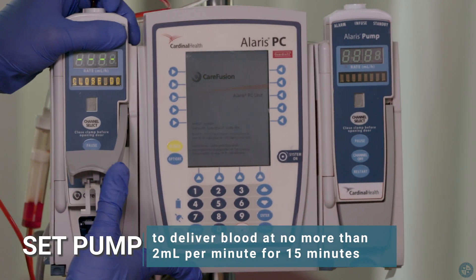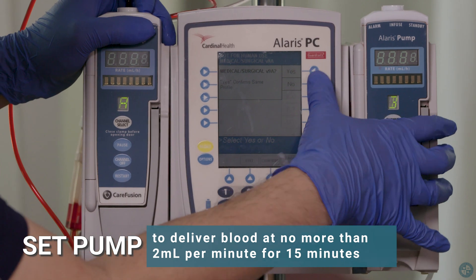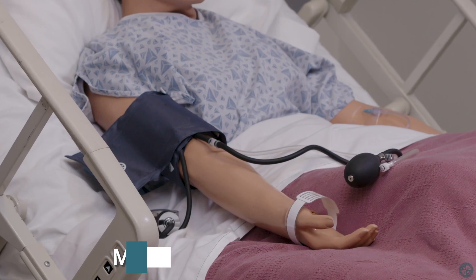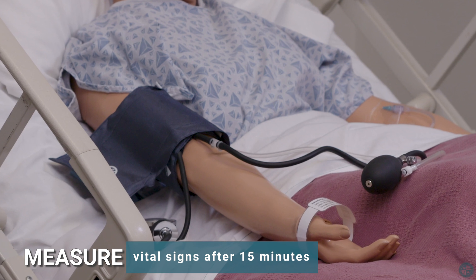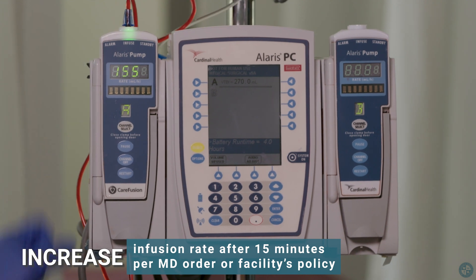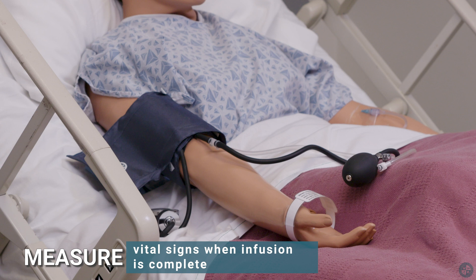Set pump to deliver blood at no more than 2 milliliters per minute for 15 minutes. Monitor patient for adverse reactions. Measure vital signs after 15 minutes to ensure patient is tolerating blood transfusion. Increase infusion rate after 15 minutes per MD order or facility's policy. Measure vital signs when infusion is complete.